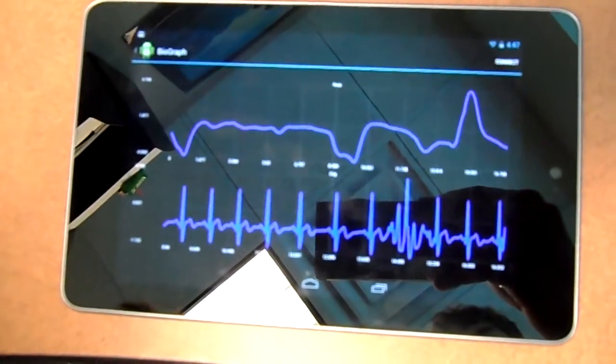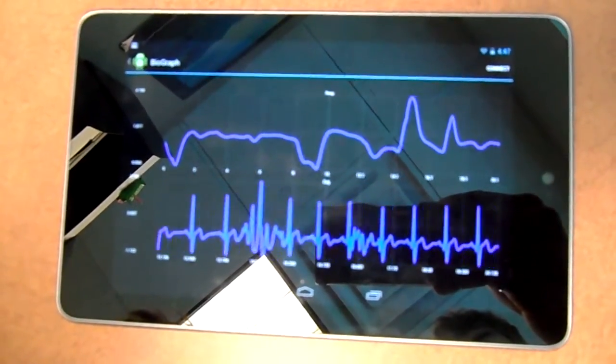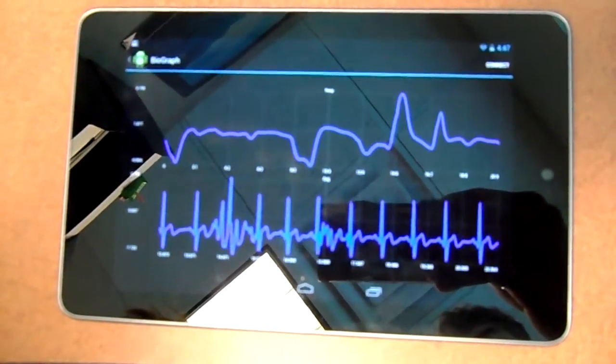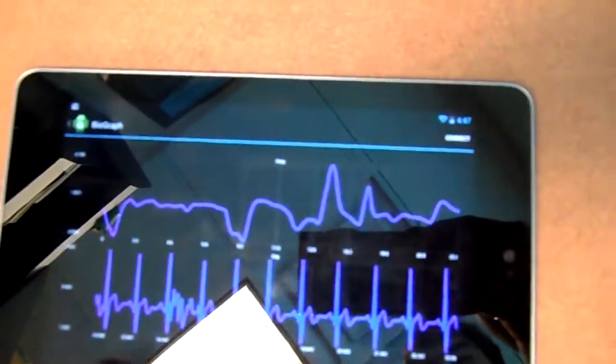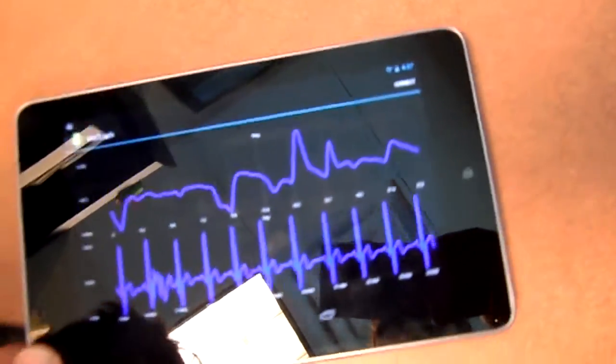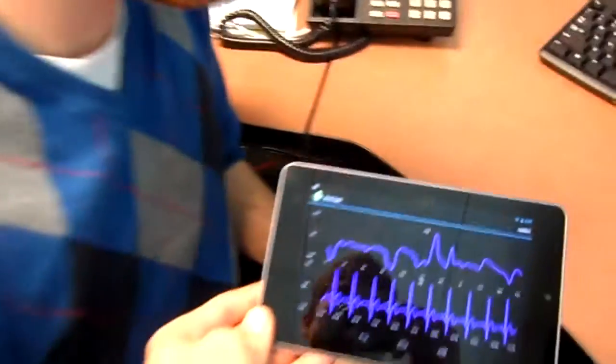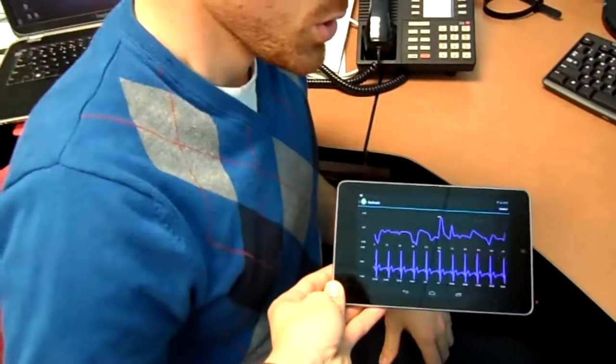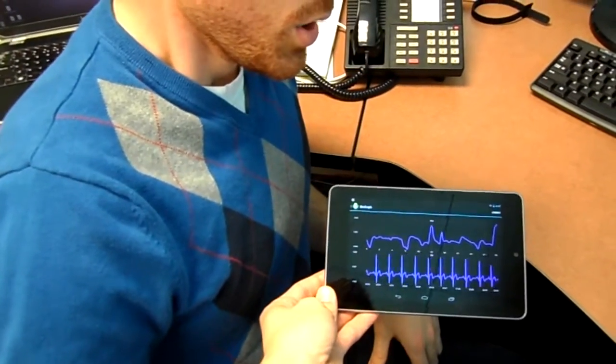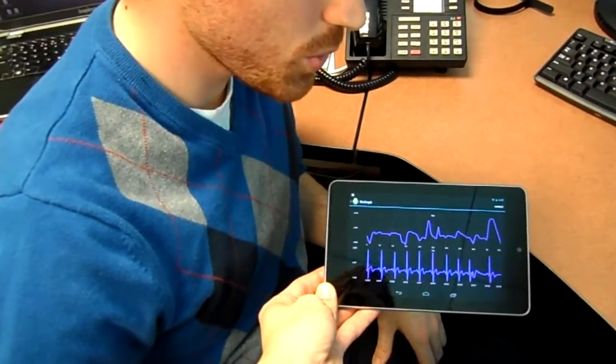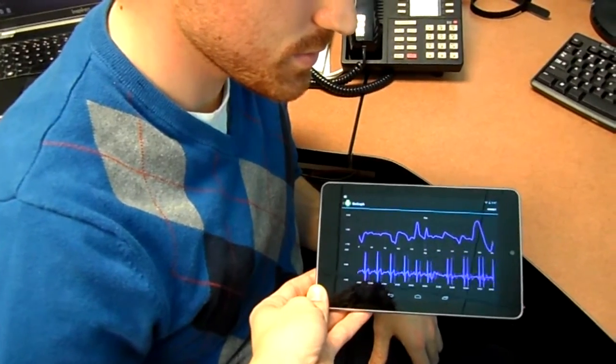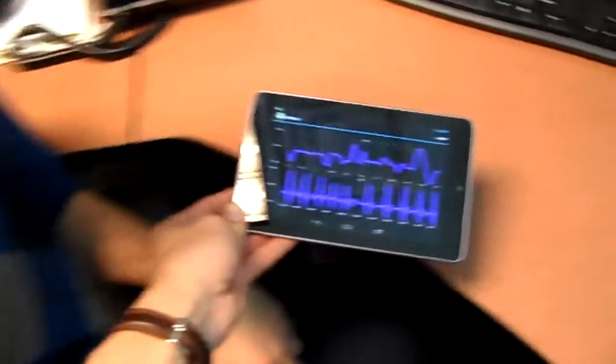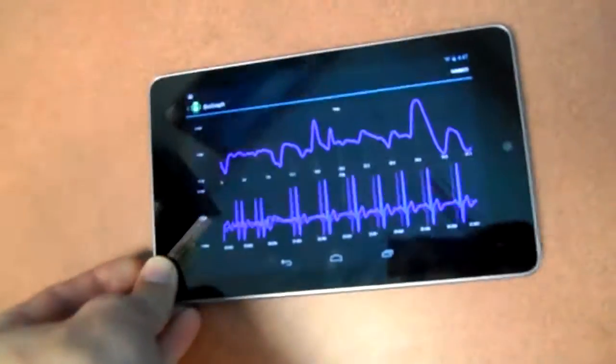If I mess with my heart rate, there you see the ECG signal affected. As I take deeper breaths or pauses, you're able to see that reflected in the graph.